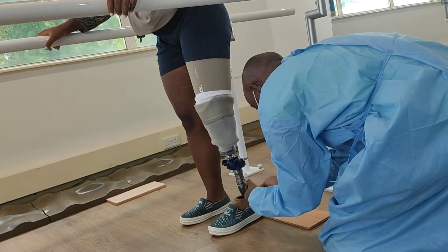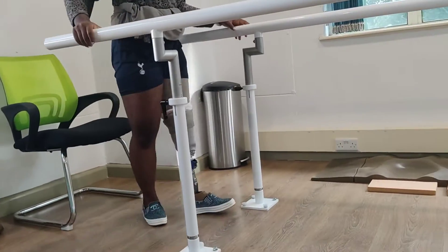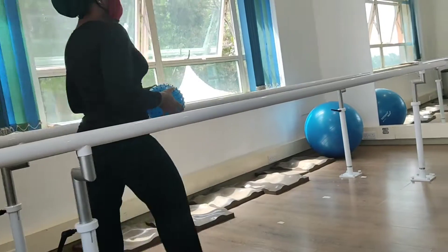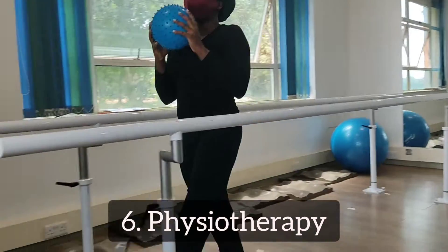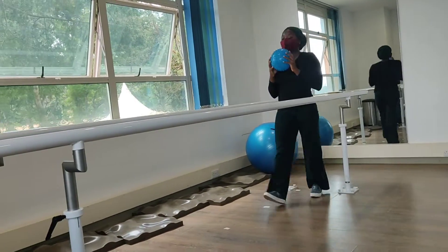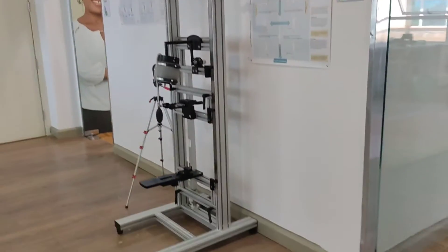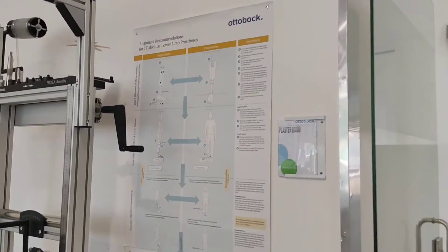Here they're trying to align my prosthesis and they're trying to balance my gait. Once the temporary socket is ready, you're going to go into physical therapy and you're going to grind and grind and move and move. Here is my physical therapist Rebecca — hi!